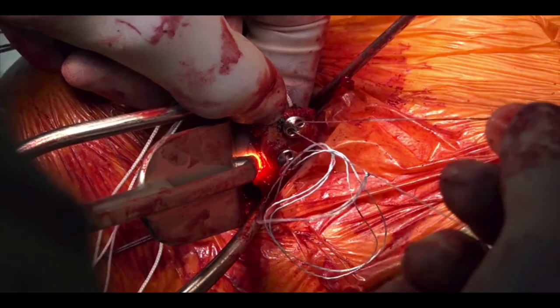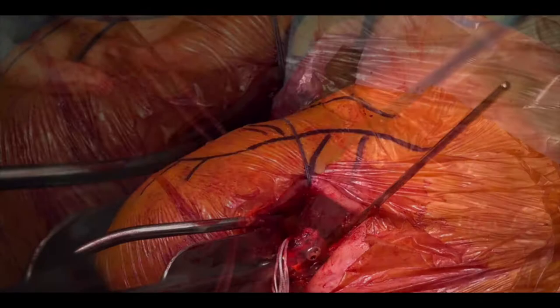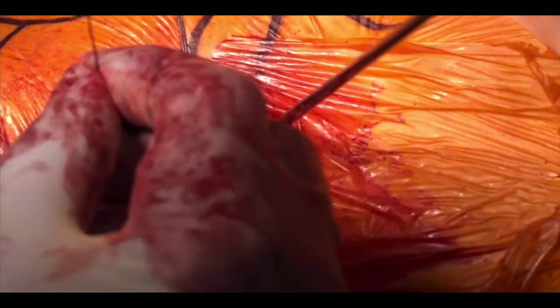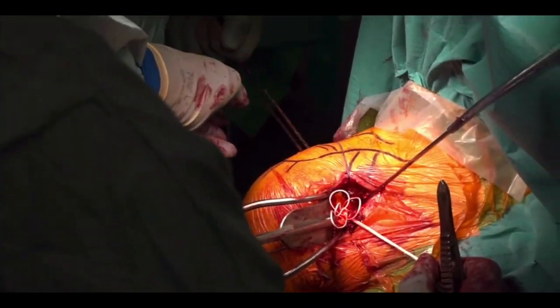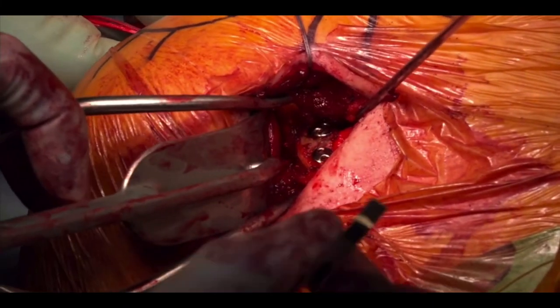A monofilament shuttle suture is then passed posteriorly through the inferior tube and retrieved from the anterior joint. The tail of the superior suture button is passed through the shuttle loop and carefully pulled through posteriorly. This is repeated for the superior button and when both suture loops are pulled, the coracoid comes into position.